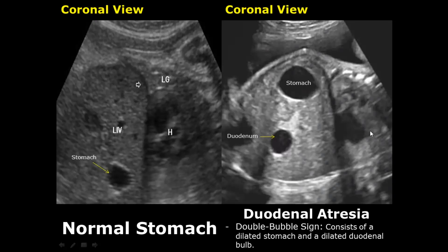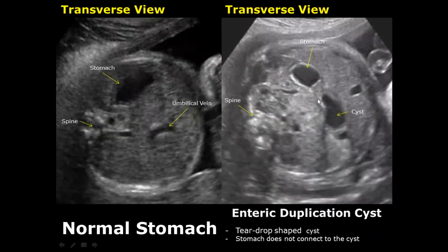An enteric duplication cyst may resemble a double bubble sign or duodenal atresia, but there is one distinguishing feature: the stomach will not connect with the cyst, whereas it will connect with the duodenum. Also, the cyst may be teardrop-shaped.